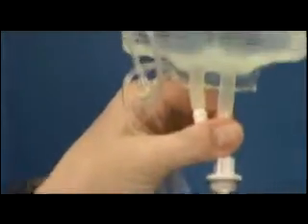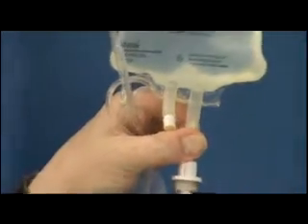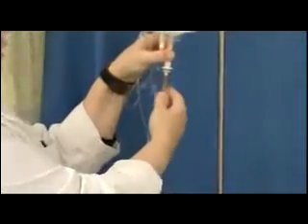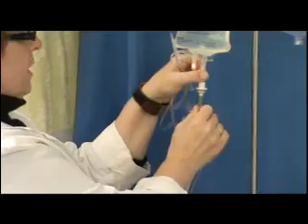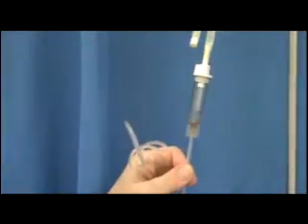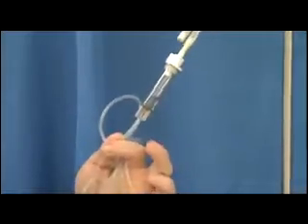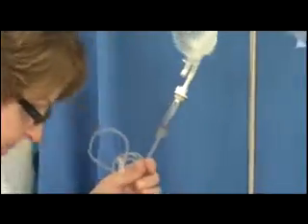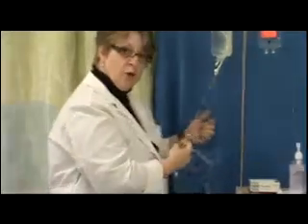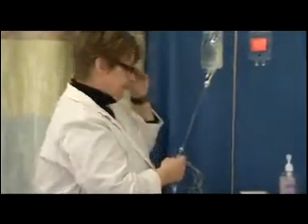Then you'll notice on the chamber that there's a little T, and that the top of the T is where you want to prime the solution. One pinch, maybe one and a quarter pinches is all it will take. You can dispose of that cap. And remember, for the purposes of this demo, we're priming it into the garbage can.